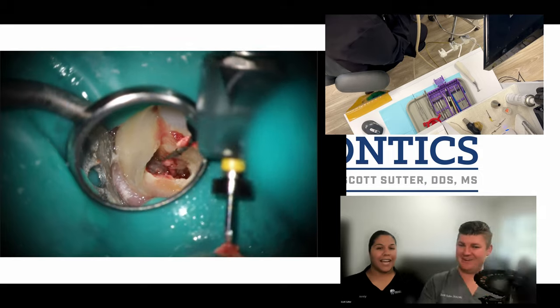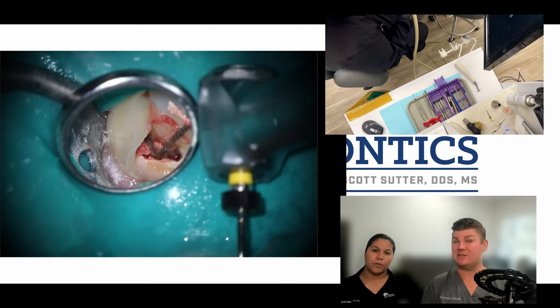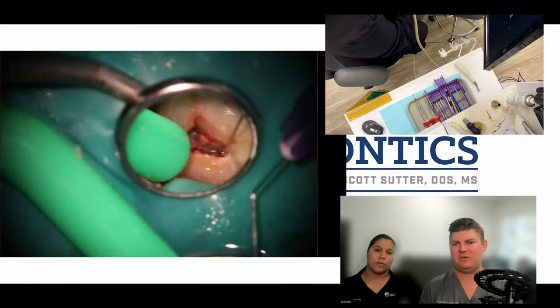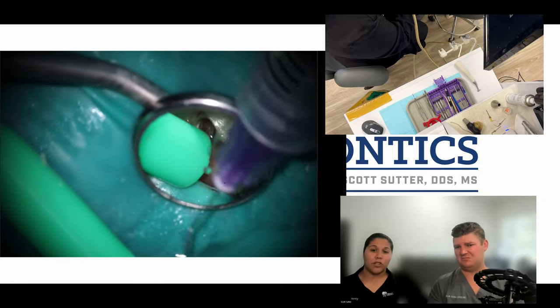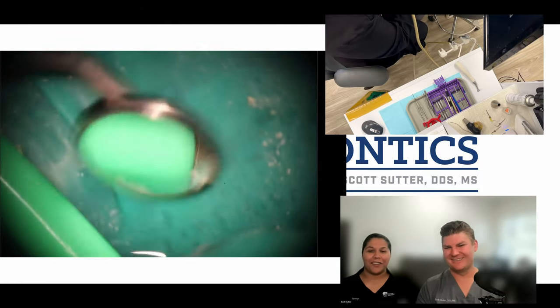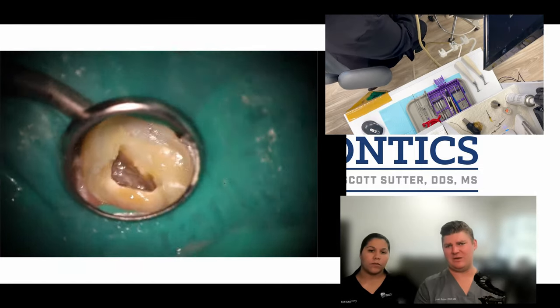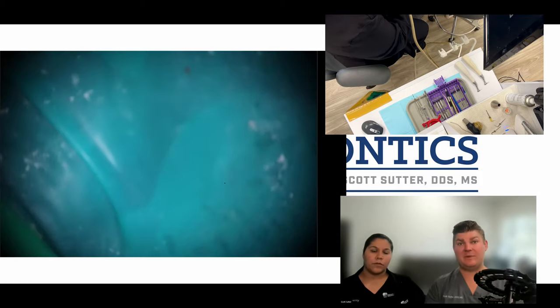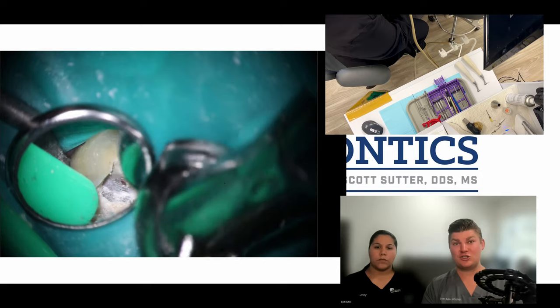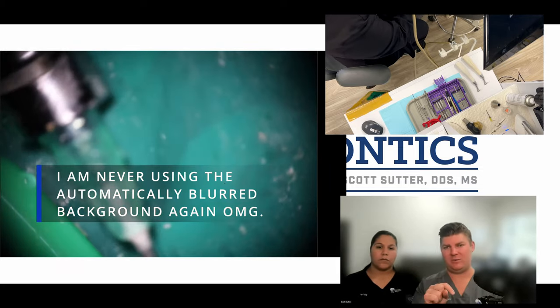No block-out on this one. Right here we're trying to find MB2. I was able to get into it a little bit with the 8C and I'm trying to grab it with the 20, but as you can see it's just not working here. So we're going to rinse that out and then go back in chasing after that MB2. I'm taking that workhorse burr and going right over where that MB2 is to open it up a little bit so I can have more of a straight-line access. MB2s tend to take almost like an S-curve when they first come in, and if you can straighten that out you get more of a straight shot down inside.